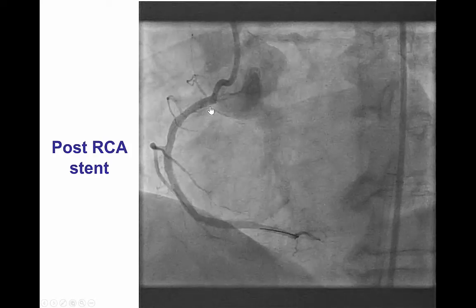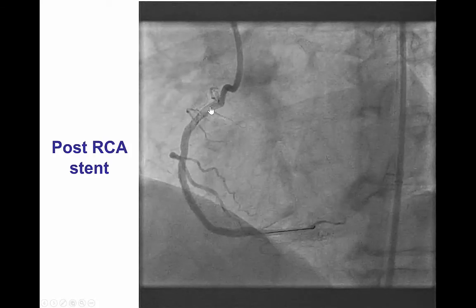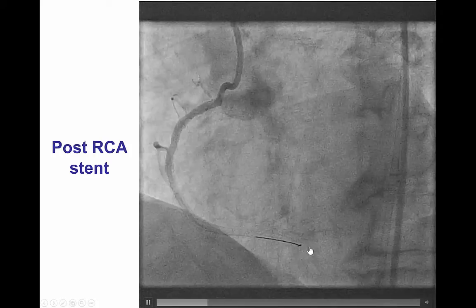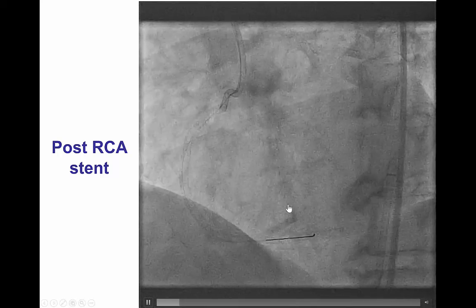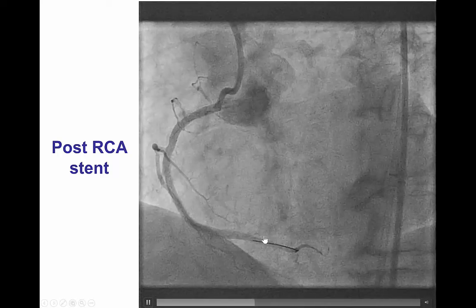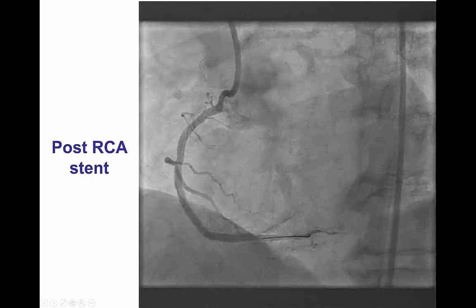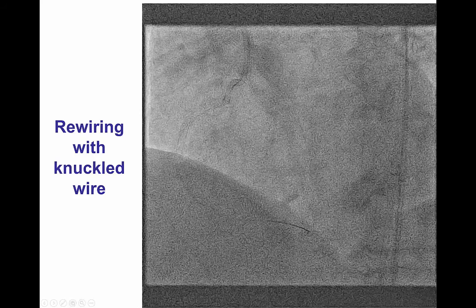Following this, antegrade TIMI-3 flow was restored all the way to the posterior descending artery. However, there remained poor flow into the posterolateral vessel.